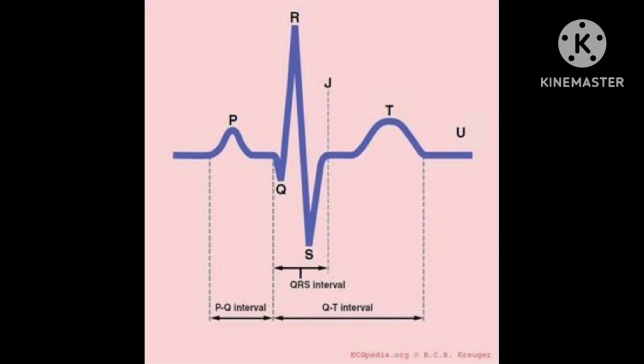Now, the important thing I am telling you is the role of electrodes. Electrodes pick up the current and transmit it to an amplifier inside the electrocardiograph. Then the electrocardiograph amplifies the current, which means it will increase. Amplifies means the value will become bigger. Okay.